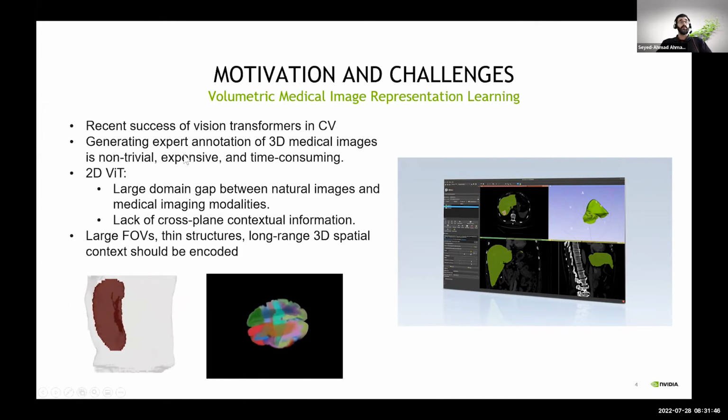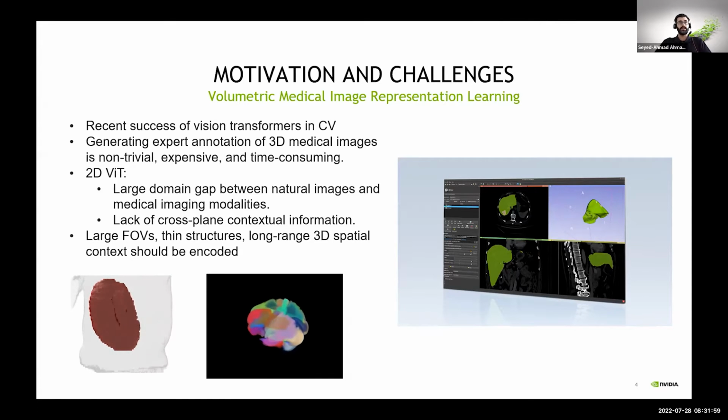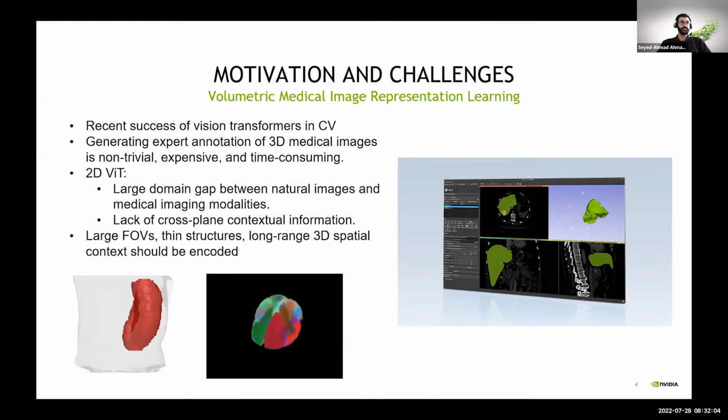On the other hand, we have the problem in medical imaging that generating expert annotations to do fully supervised training is pretty expensive. It's really non-trivial. You need experts for this, which makes it so expensive, and it is very time consuming because 3D annotation is usually more work than doing it in 2D.